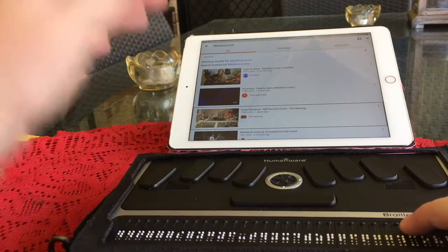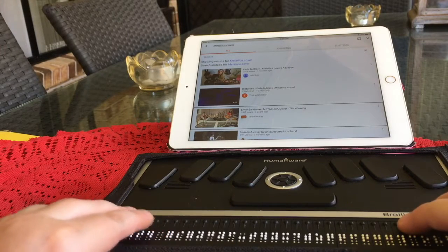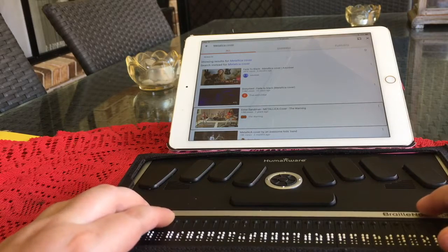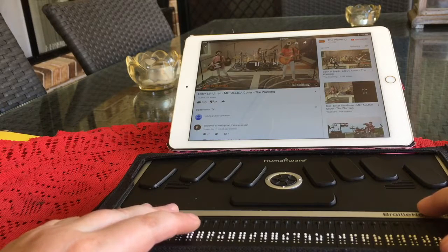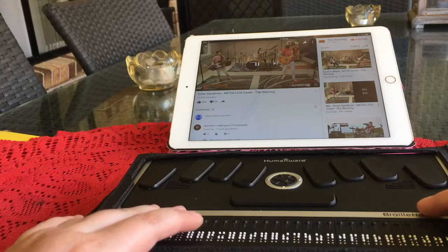Okay, Enter Sandman — okay, that'll do. I'll click that. And this time I'll use one of my router keys — can be any router key. Now, this brings me to another useful gesture we can do.